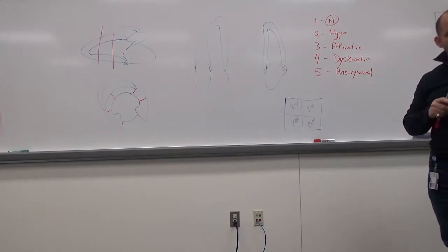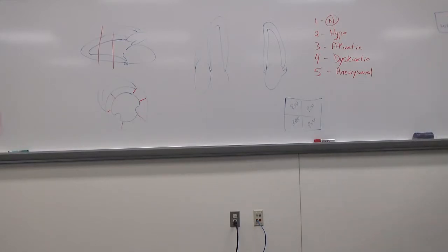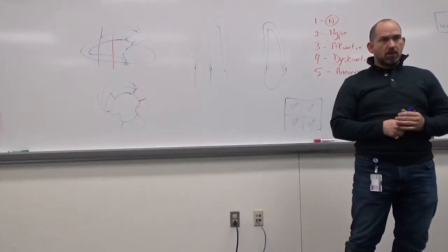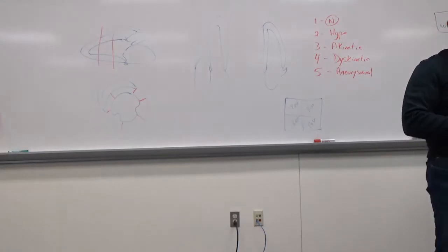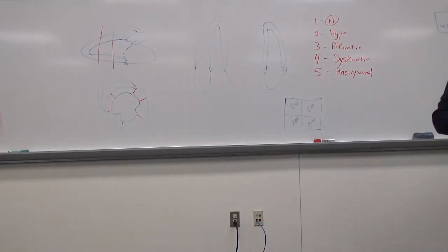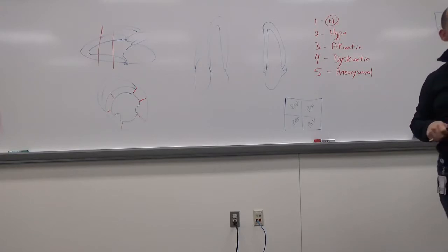So having said that, I mentioned the treadmill. So what types of exercise, what types of stress tests do we have? Exercise and medication. Yep, so it's either pharmacological or exercise. So medicated, pharmacological. There's a few different agents, the most common being dobutamine. Okay, that's the most common by far.